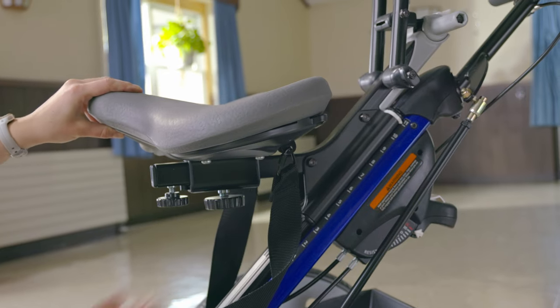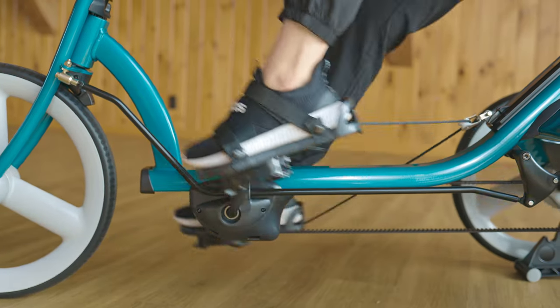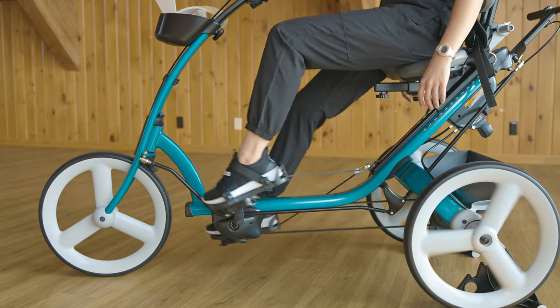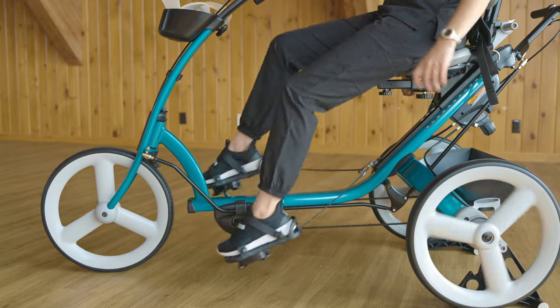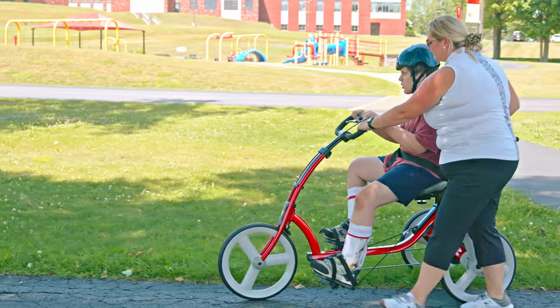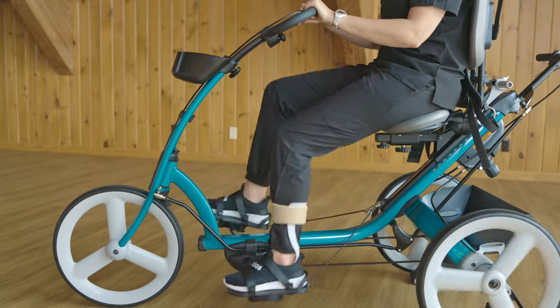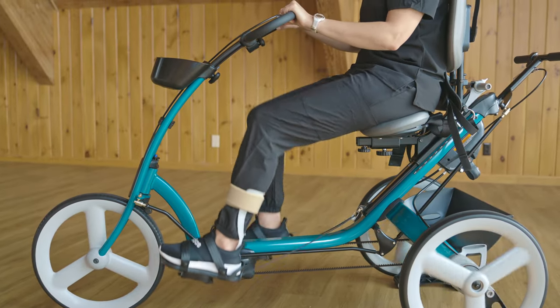The seat can slide forward and backward while the rider is on the tricycle. This adjusts the hips and knees relative to the pedals, which can be a game changer. Some people use their extensor tone to propel the tricycle, cycling best with their hips and knees more extended and their plantar flexion tone powering them forward. Others have better success pressing their feet downward with co-contraction of the quads and hamstrings, so we might move the seat forward to place their knees directly over the pedals.